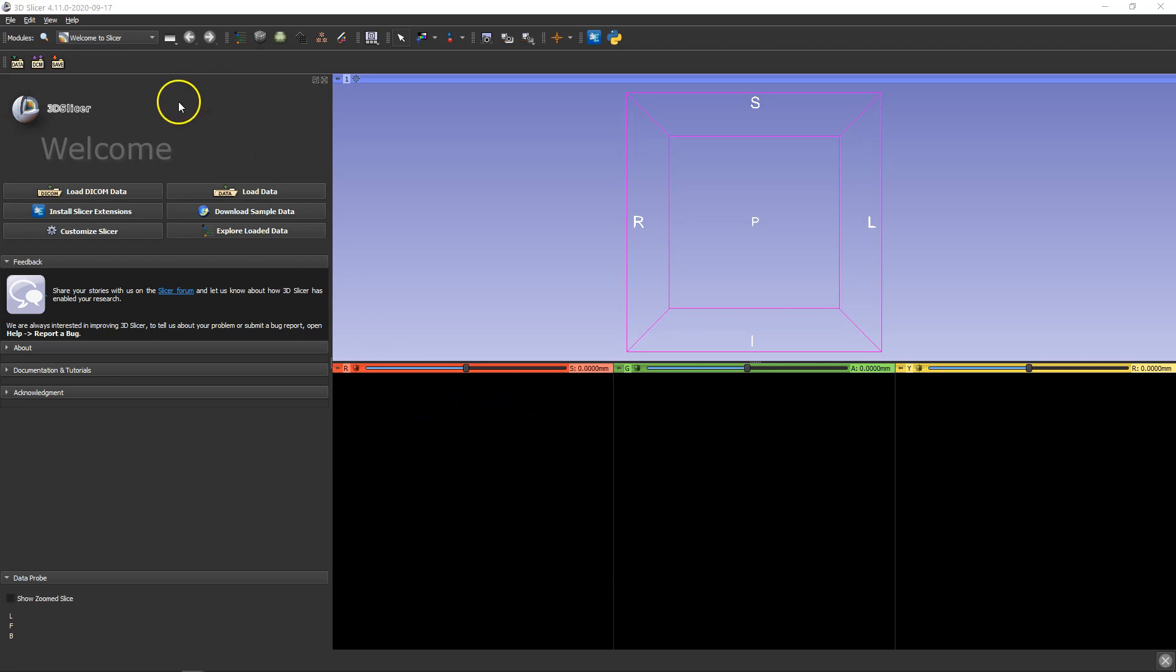I'm going to be doing a bit of segmentation work in 3D Slicer. I'm using 3D Slicer 4.11.